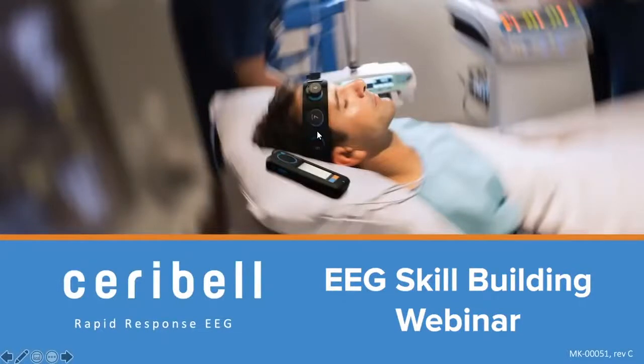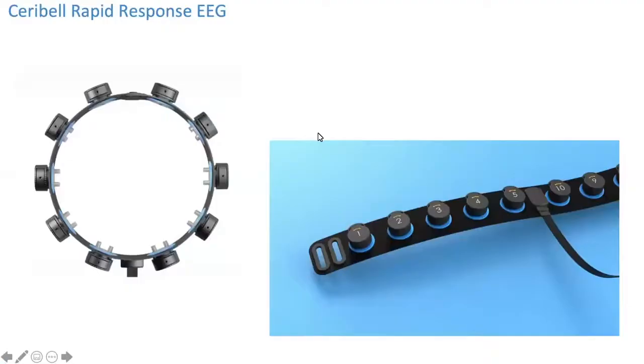Welcome to this webinar. I would like to start by emphasizing that Ceribell EEG is like any other EEG. It is recording electrical activity from the scalp. So it's an FDA-approved EEG machine, and it does what any other EEG machine is supposed to do.